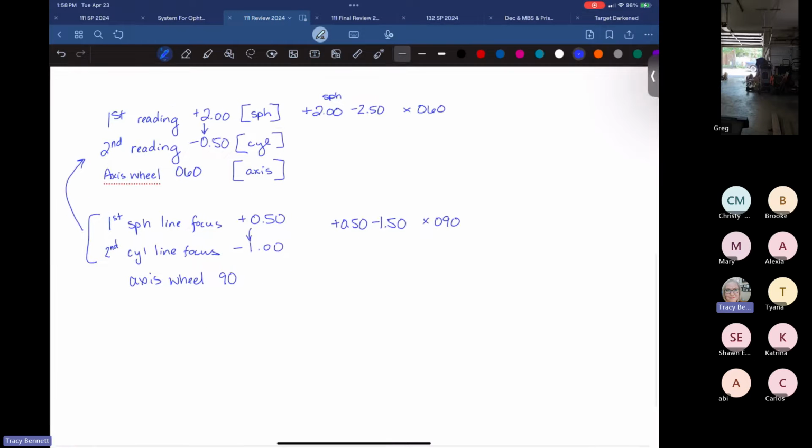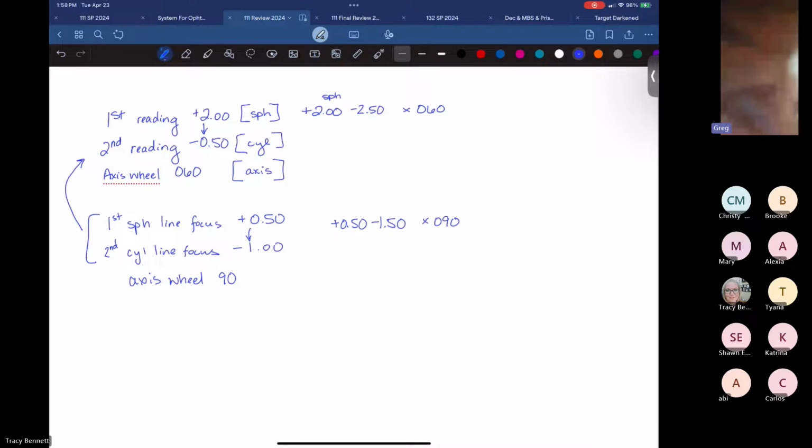All right. Well, those should be pretty good. What's the center thickness gauge measure? Center thickness. Yep, measure center thickness. Where do we measure the center thickness?